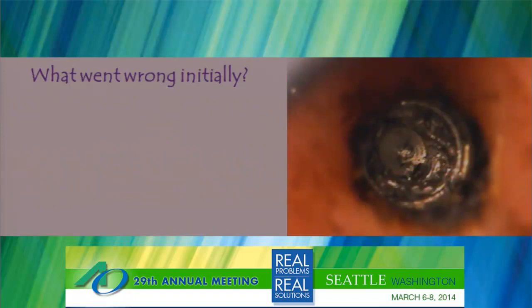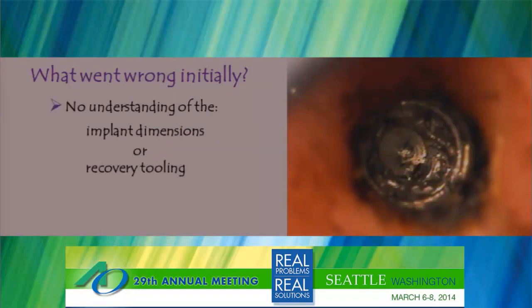Well, what went wrong initially was that the dentist didn't have any understanding of implant dimensions and the recovery tooling that he went into this implant with. And obviously, the excitement and the fear of failing probably complicated the situation as well. Secondly, he didn't have visualization, which is a critical key here. So going in there, understanding that you can do damage and you can create problems is huge.